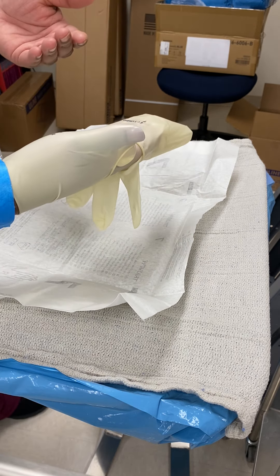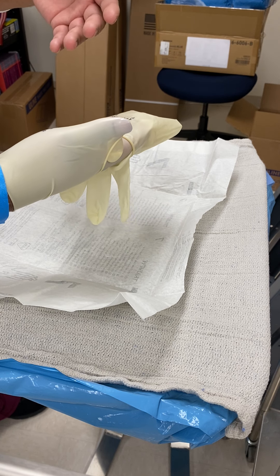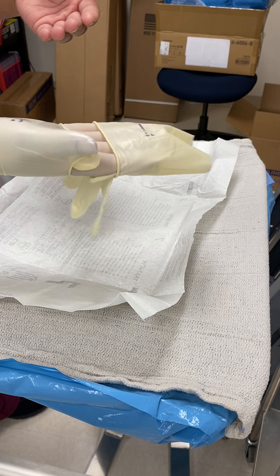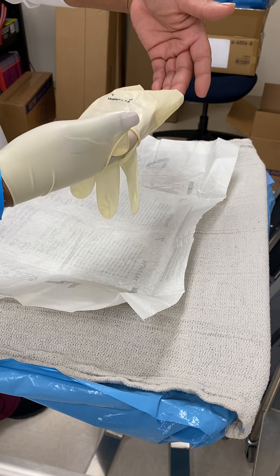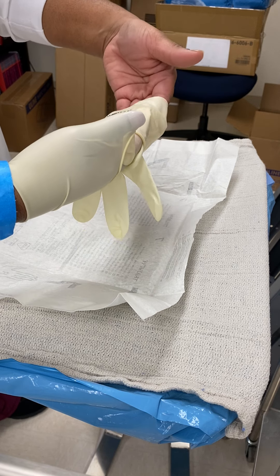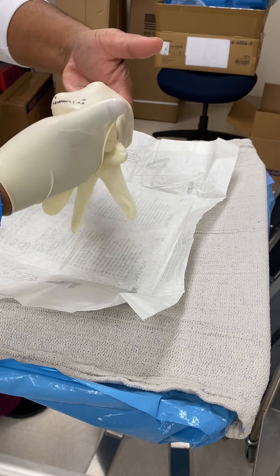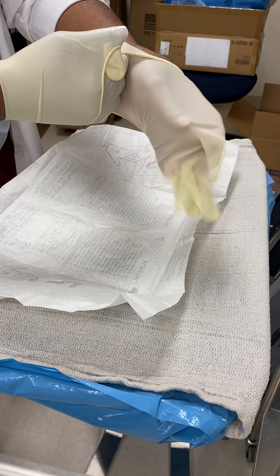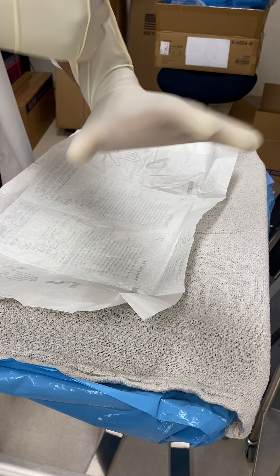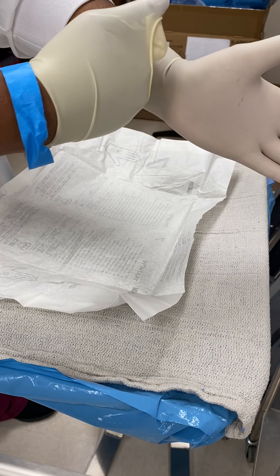You use the gloved right hand and you're going to pick up the folded cuff so that now you kind of have what I just showed you. Then you're going to slide your left hand into that particular part. Once you get there, if you notice, my hand is still protected — and let go.